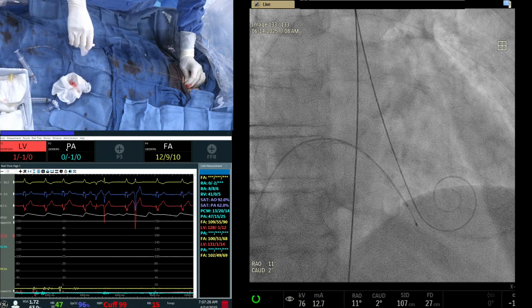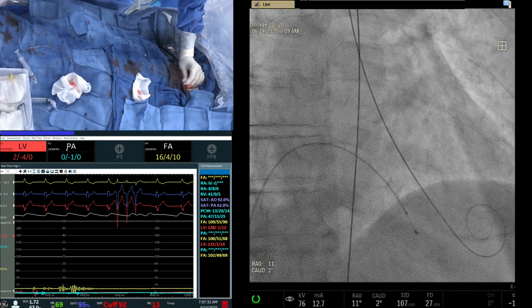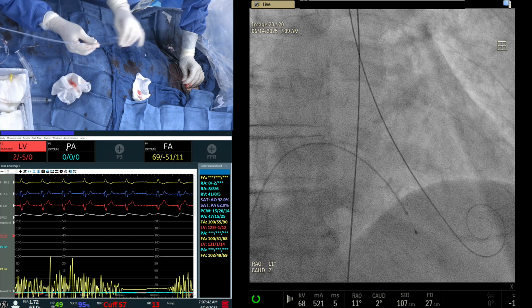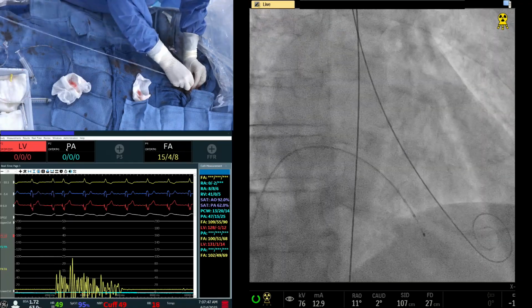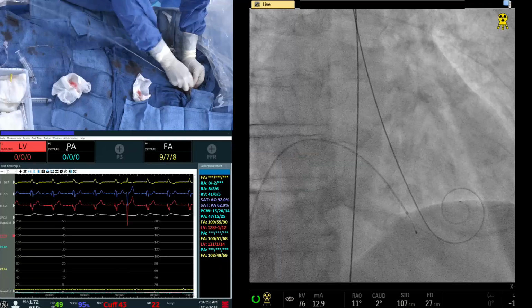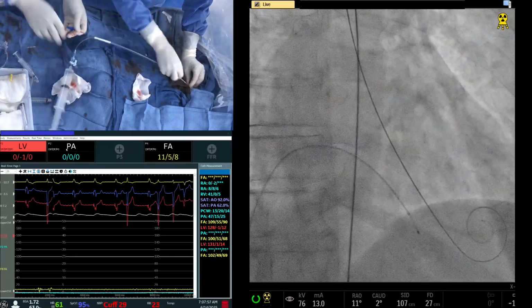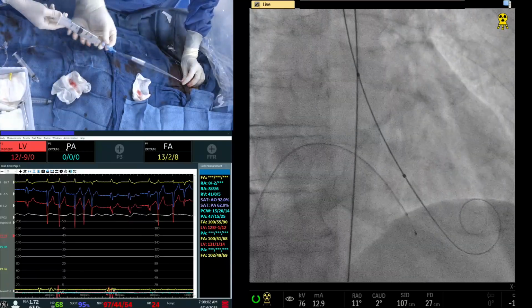But with a 40 millimeter peak gradient and such a tight left main bifurcation, would you really want to do the BAV, or just go ahead and straight do the LM bifurcation and come back? That's a very good point. Believe me, we started this policy a long time ago, and if there is a severe gradient, we saw that even during PCI they get into more trouble. Because of that, we have tried, and we now actually have multiple cases of this combination. Now, we either do nothing or just go to 180 quickly, or 150.